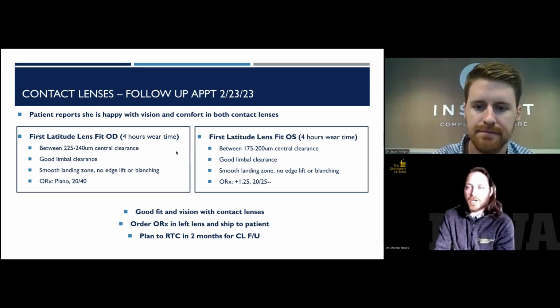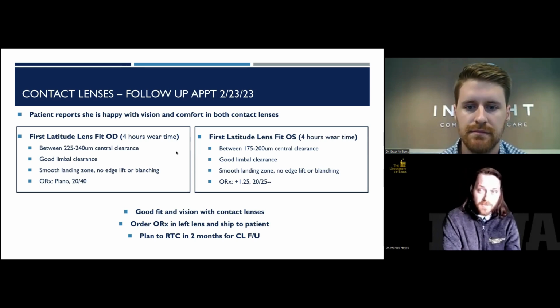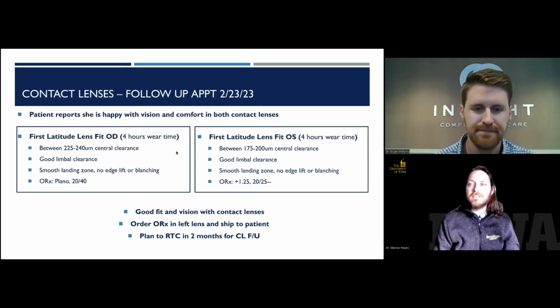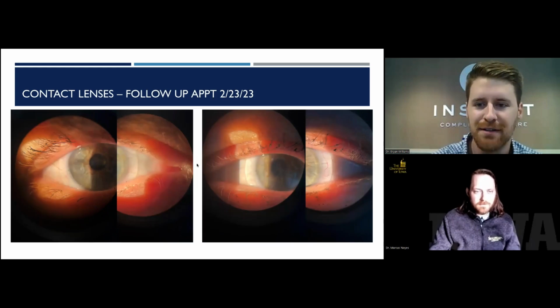Yeah, I just want to clarify what we were just talking about, where you checked the over refraction first, didn't apply it. You waited until the follow-up. Then when you confirm that over refraction is stable, that's when you added it. Yep. Excellent. Thank you, sir.